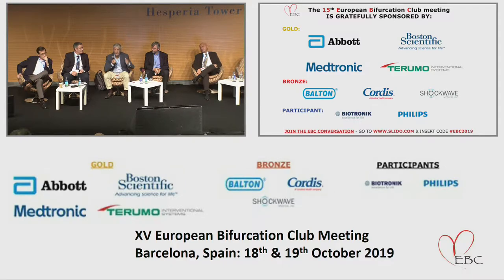That's an operator-level decision. And the problem was the diffuse disease in left main, because we don't see any reference. In many cases, the whole length of the left main is diseased. And in this case, we decided to use the smallest external elastic membrane area, the smallest, because sometimes you see tapering, and to get 90% of this area as the hypothetical target. It was useful because at least young operators have something to use as a reference, because it's very difficult, no?